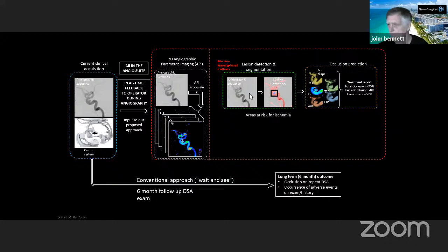Okay, so and then not only does it find where it is, it segments it out, which means it takes only the area of the aneurysm and extracts those parameters out, and then it makes a prediction. My talk today is about how we do this with AI, but I also want to show you evidence that all this data is supported.